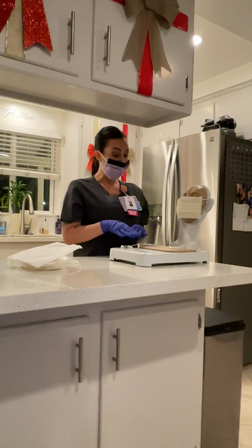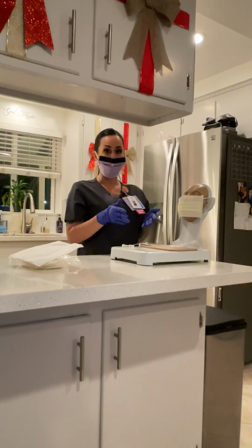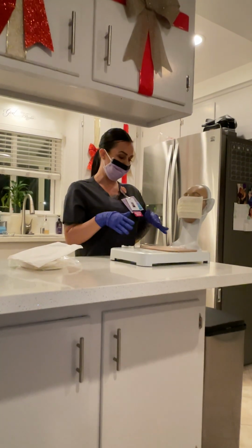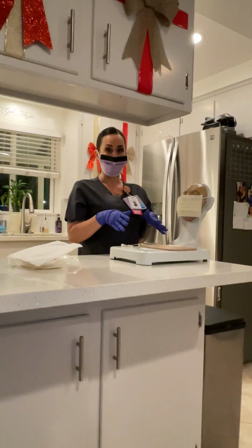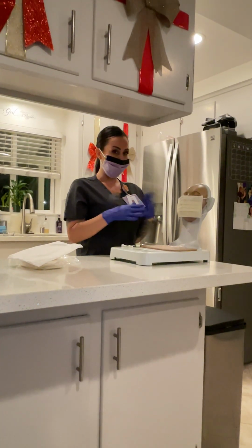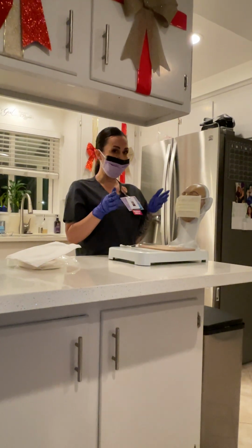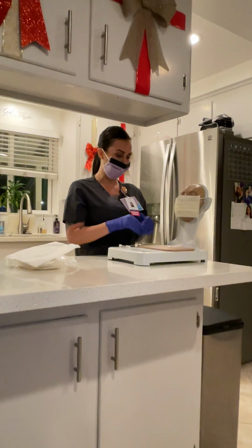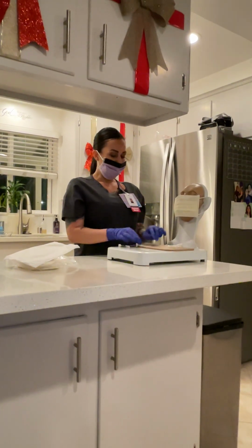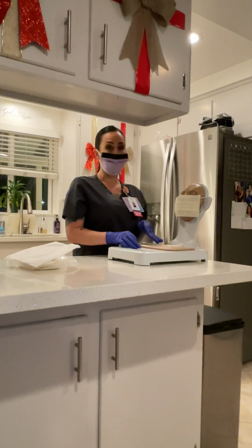Next, we're going to inspect the site. We want to look for any redness, any drainage. We want to look for any swelling, discharge, or just any kind of signs that the site might be infected. All right, once we are inspecting around the skin again, we just want to double check there are no rashes either, any swelling, or anything that could have developed since having the central line put in. We also want to look at our catheter and make sure that there are no kinks inside of it, or that it is not dislodged.